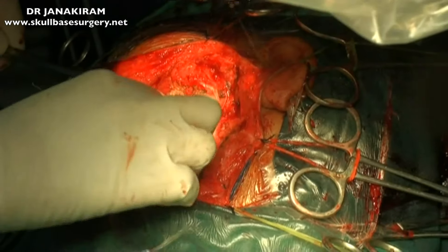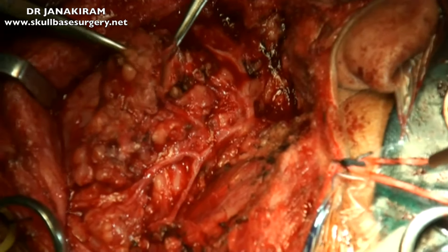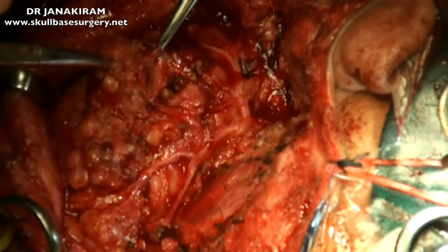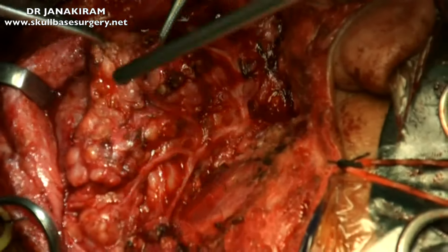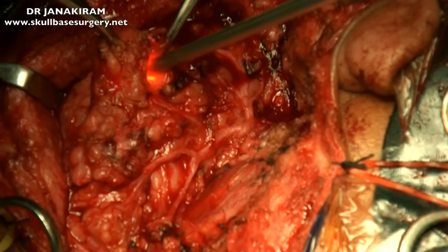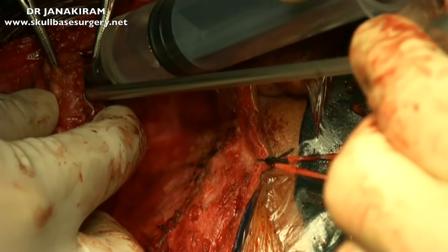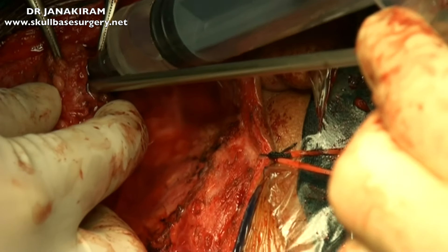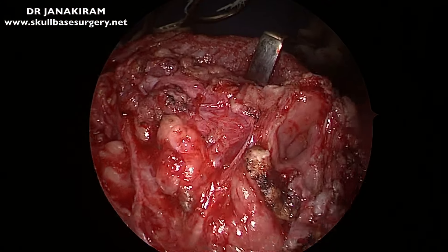In this case, this is the final view which you get — you get all the branches of the facial nerve. Of course the superficial lobe has been removed. In this case we did something very new — I think possibly the first time in the world. We introduced the endoscope through the duct, something like a sialendoscope, done through the duct which is very dilated.